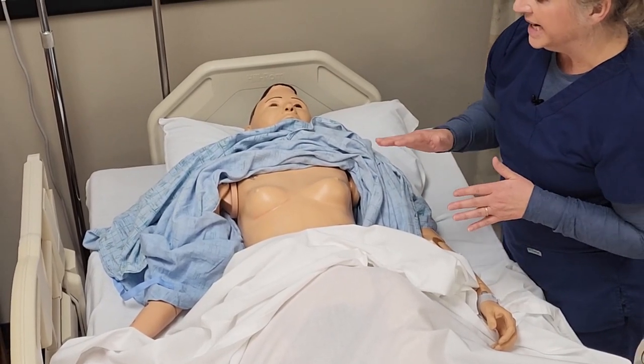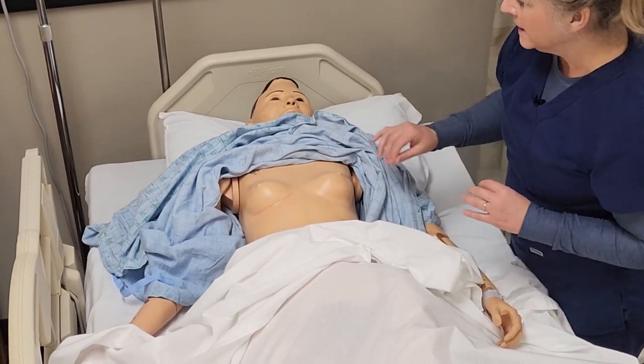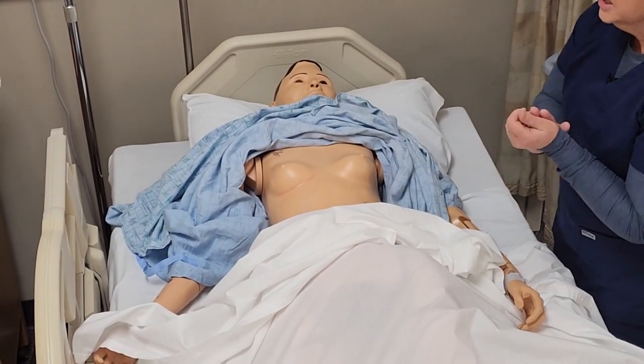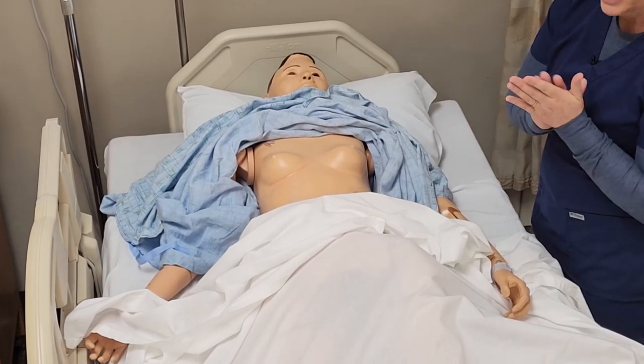When the electrodes are on hair, it doesn't really provide a very good conductive waveform. With our patient here, the chest wall is exposed. You can utilize prep pads before you put the electrodes on to make them stick a little better.